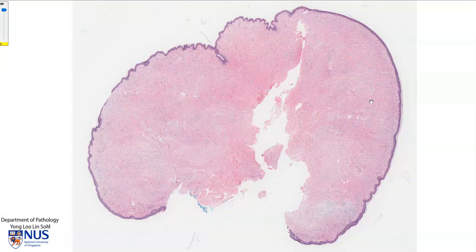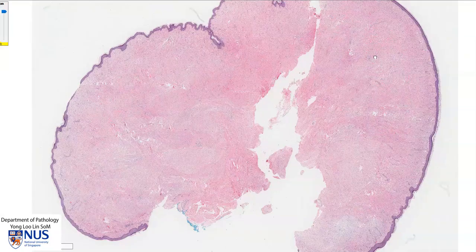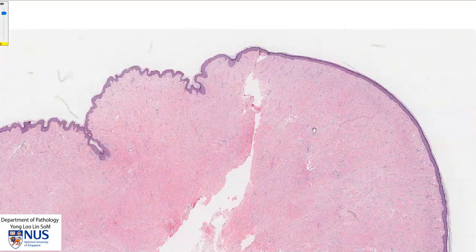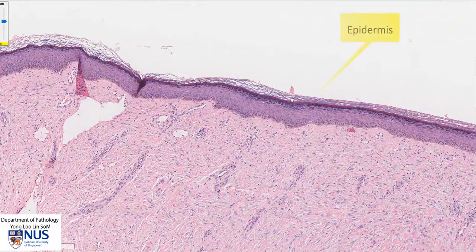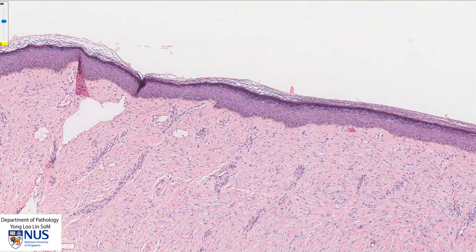We have this oval, firm nodule that extends beyond the confines of the original wound. On the cut surface, we can see that this is covered by benign epidermis, which comprises stratified squamous epithelium and also a keratinized layer of anucleate cells on top.